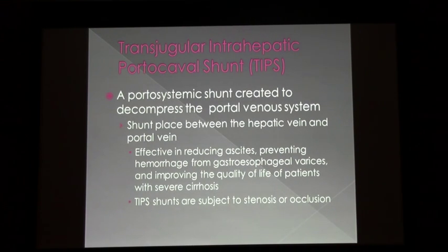There's all these variations on how they insert when they even come in utero. What you want to do is see, A, if you've got a collateral, and B, what is the direction of flow in that collateral in relationship to the portal vein. So if you can trace it and get it to the portal vein, ideally it'll have a reversal of flow from what you would have expected. That's what I was kind of thinking, because it should be going backwards.